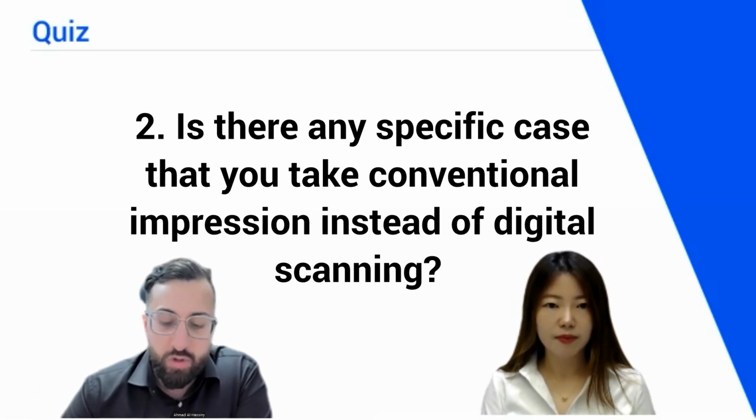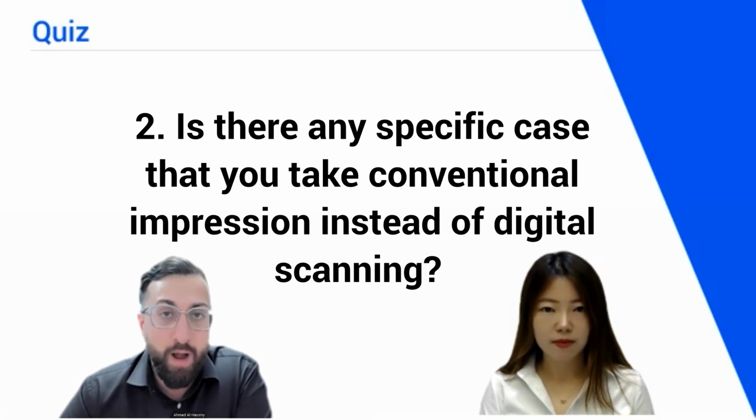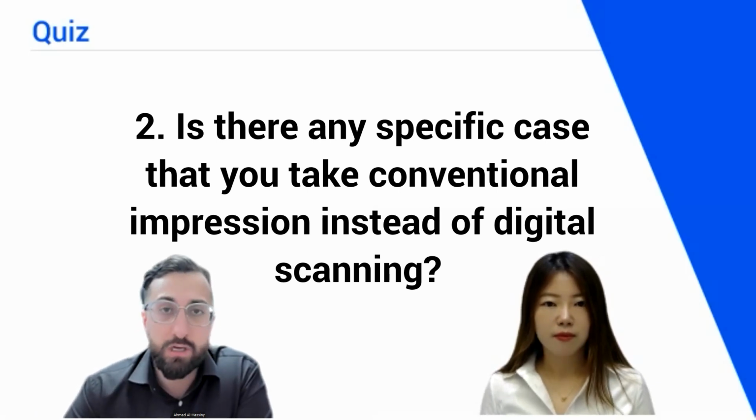Otherwise, I do not take physical impressions for any other indication in my practice, including full arch, implant restorations, including implant bridges. Everything is scanned.